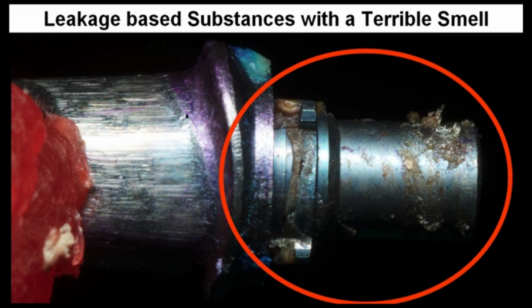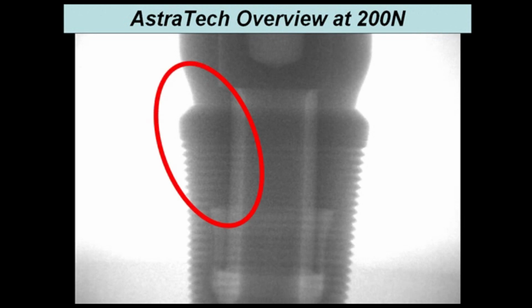And try it. If you use flat-to-flat interfaces, remove the abutments after 1 year or 2 years and smell it. It's really terrible. This will not occur if you use conical interfaces, based on the fact that we have no microgap inside. So if we load it, the AstraTech system looks like a virtual one-piece.